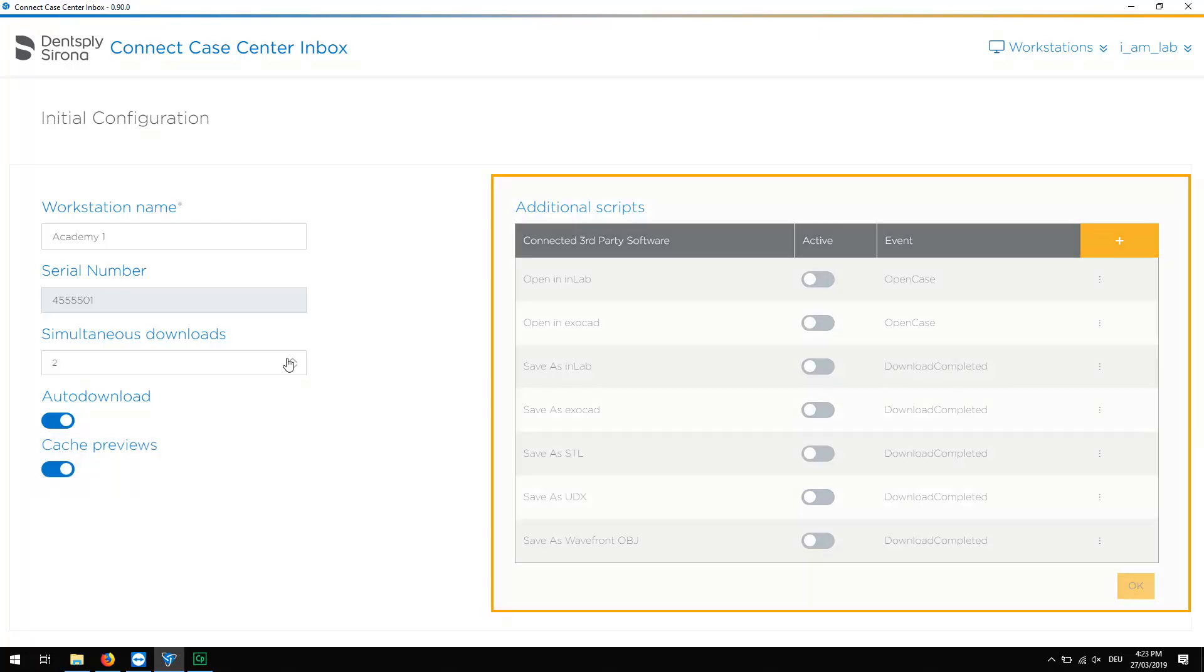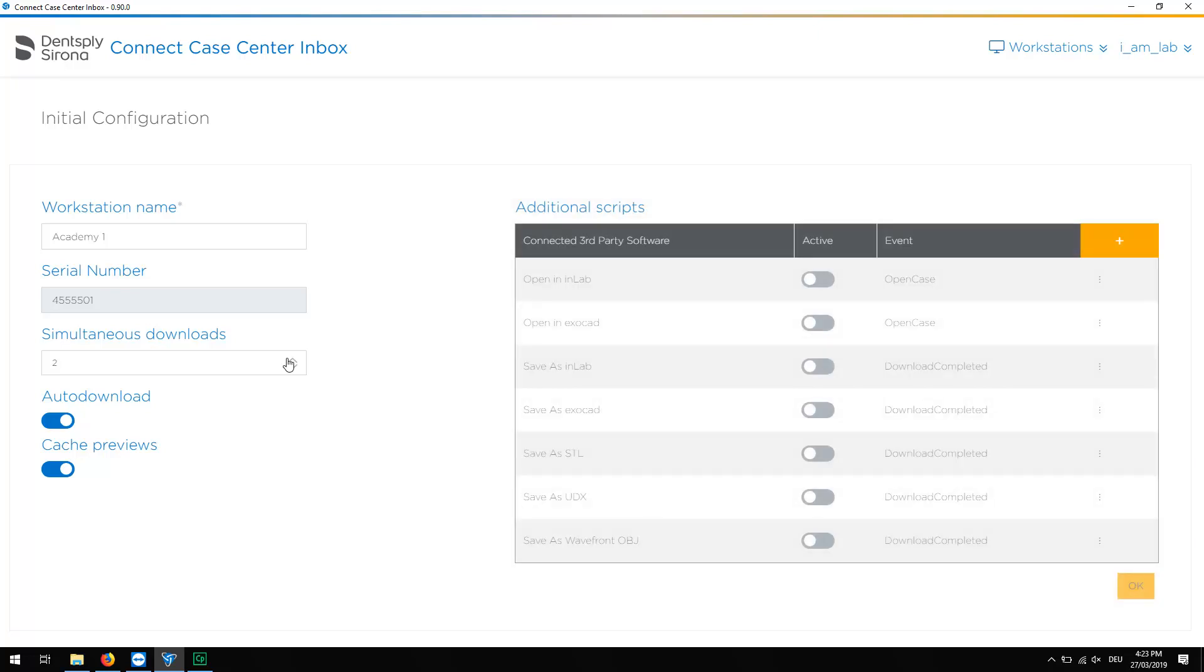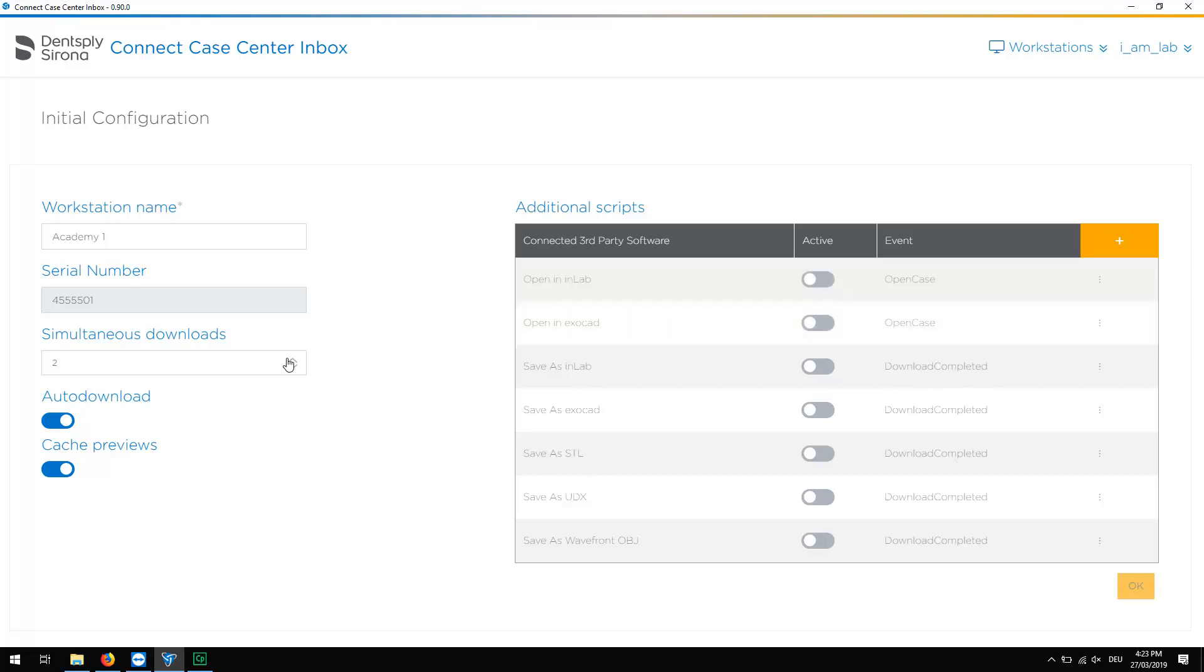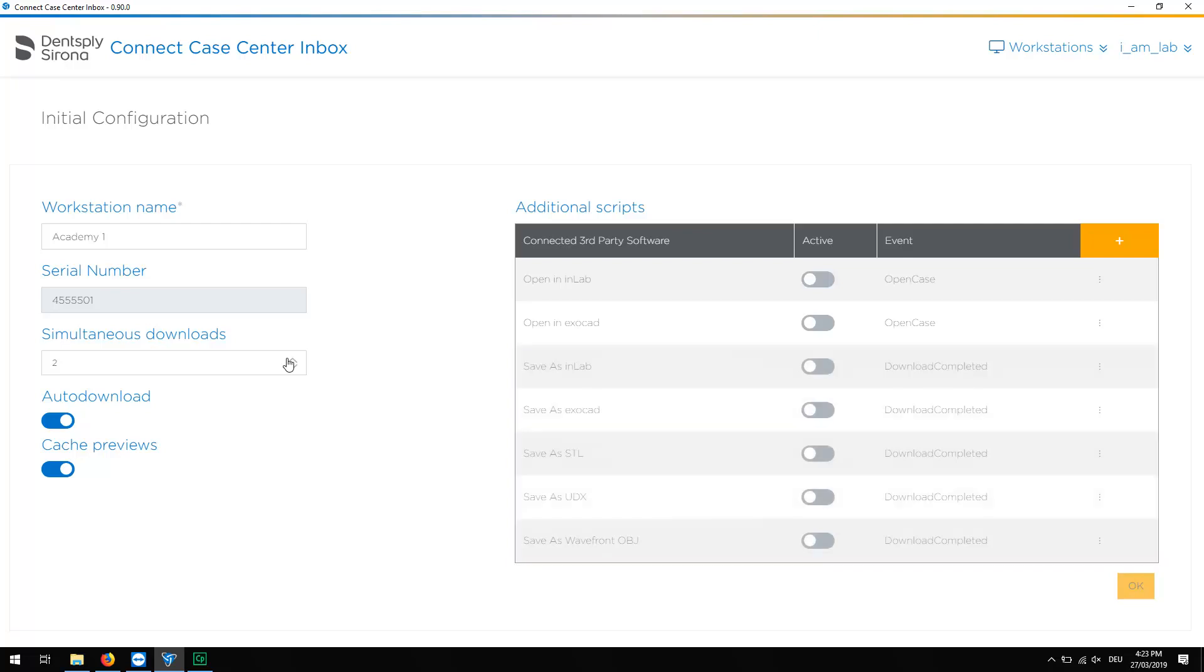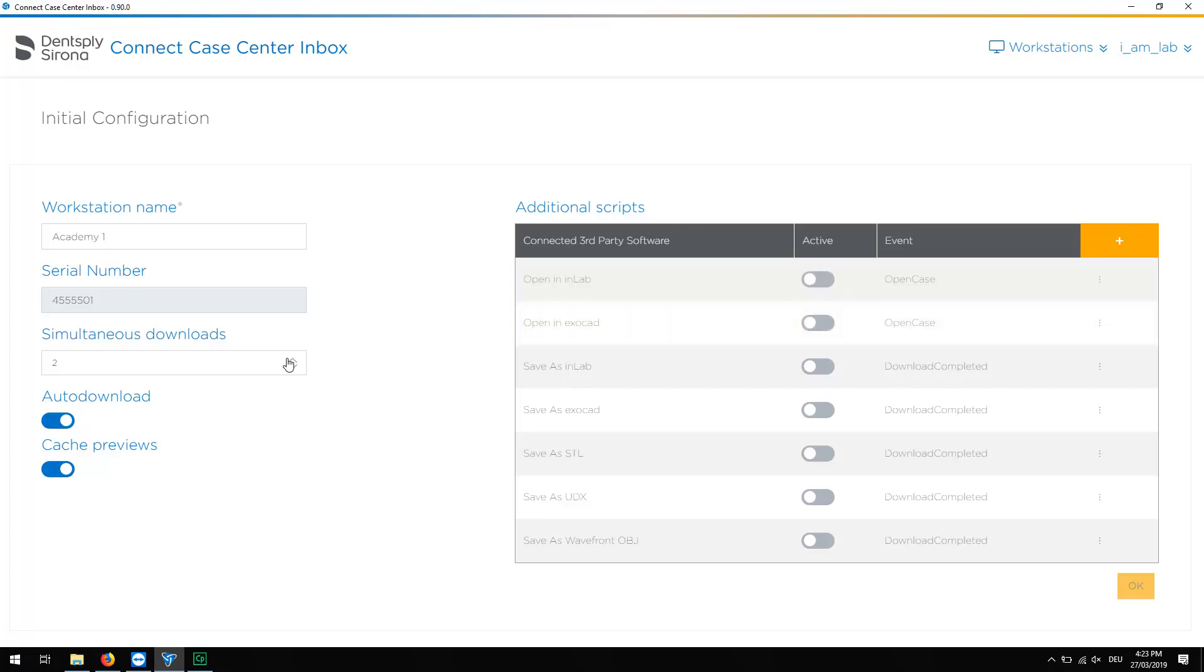To the right of this, the scripts are located. The scripts listed here are preset and can be activated. You can choose to open cases with one of the applications listed here, or you can save them in a variety of formats. Activating the option Open In allows you to open the case with the respective software after download.